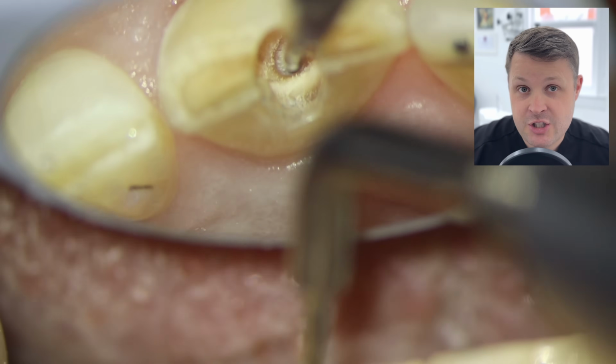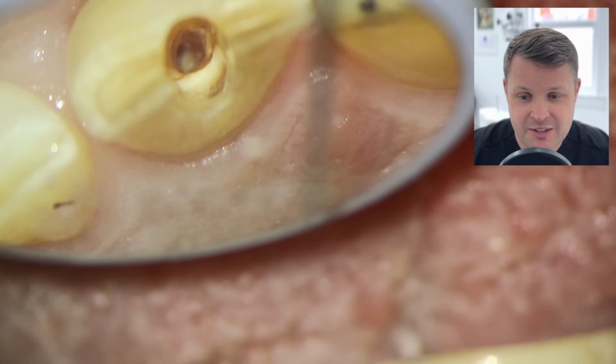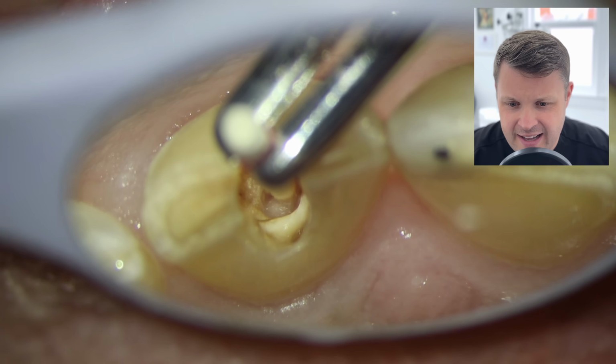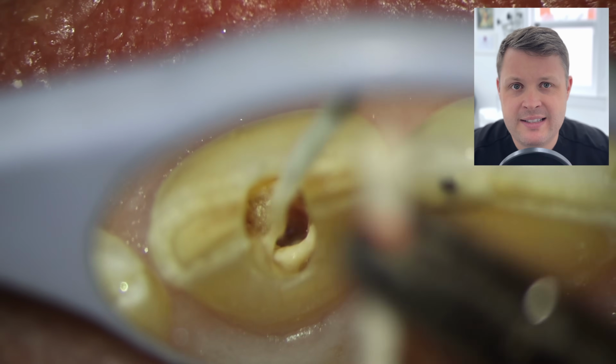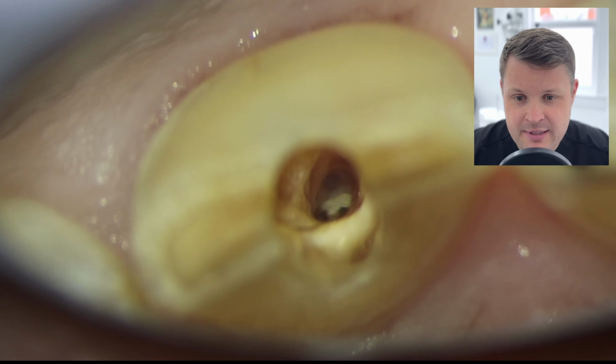It's at this point I don't realize that I'm off center, and at this point I'm going to perforate it soon. But as I place my paper cone to length, I have a look at the tooth. I feel like I'm within the right direction of where I should be. However, this is the point where I am definitely going in the wrong direction.